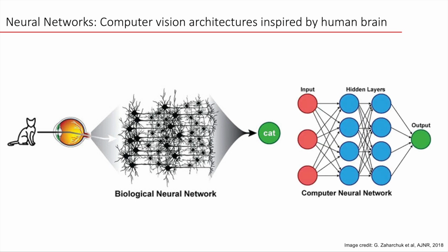So the basic idea of these computational neural networks is to replicate this amazing process by having multiple layers of neural-like elements that can detect initially very elementary shapes, edges, color, and then as information is passed on into deeper layers within the neural network, more complex and diagnostic patterns can be generated, and then eventually the computer will use the high-level features that are constructed late in the neural network to make a specific classification.